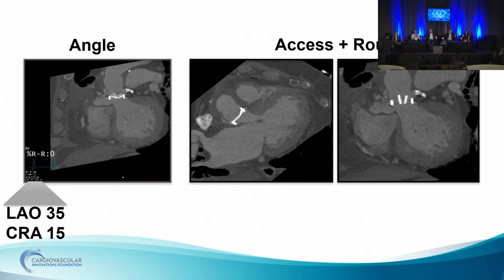Terumo does too. The challenge with these is that you have to get the whole thing closed. Because if there's one red blood cell that's still going through, this will stay open. And to me, I would put a bunch of coils in. It doesn't look like you have a whole lot of distance to cover too. And does everybody agree with the ADO2? How permeable is that? It's permeable, but the coils are nice there.